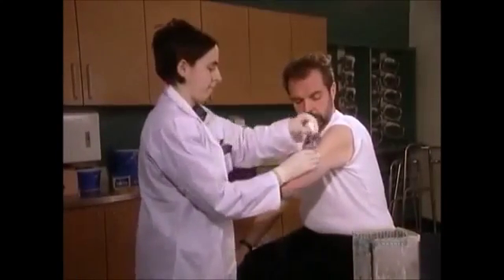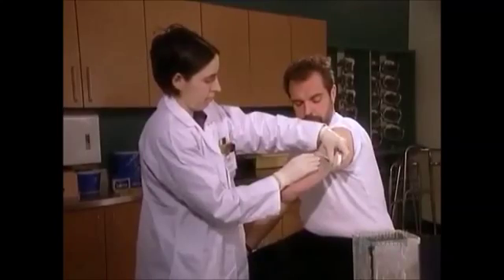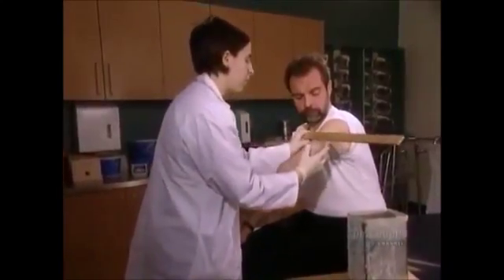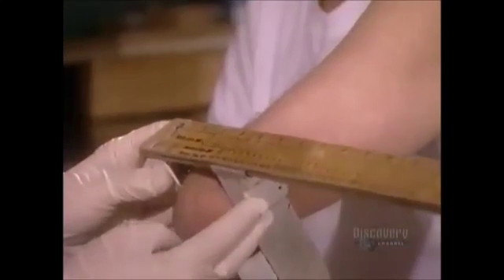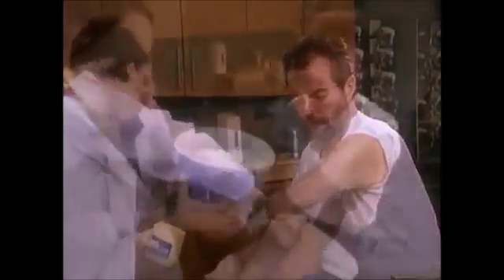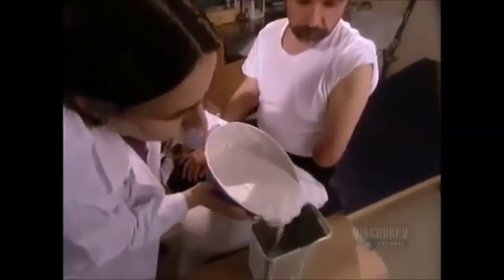They start by measuring the amputee's stump — what doctors call the residual limb. First, they measure the circumference at different points, then the diameter at different points. They protect and lubricate the residual limb by coating it in petroleum jelly.